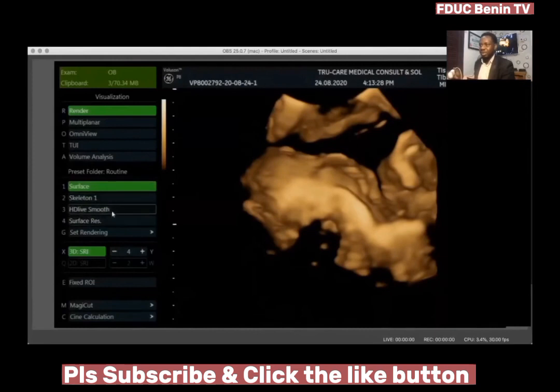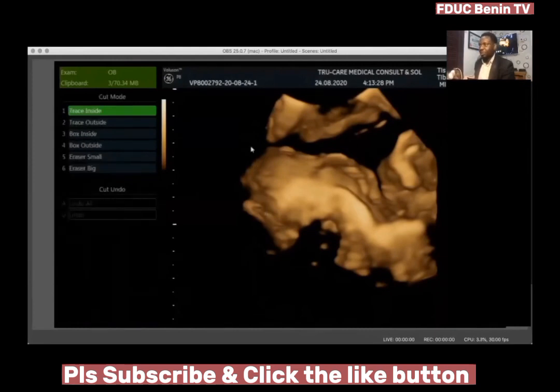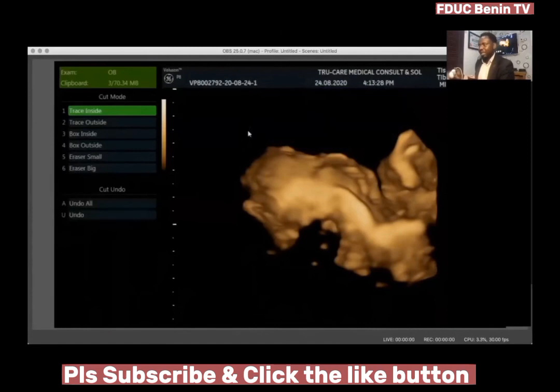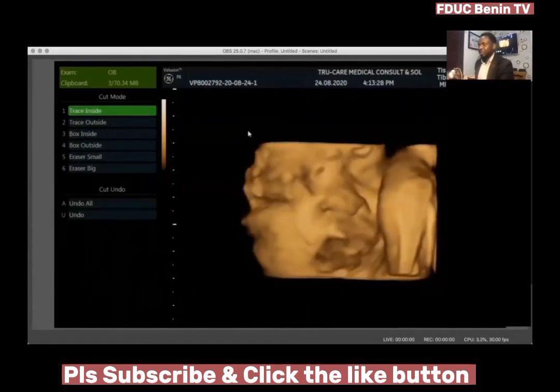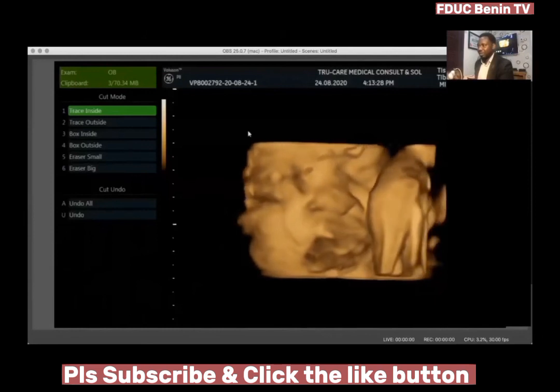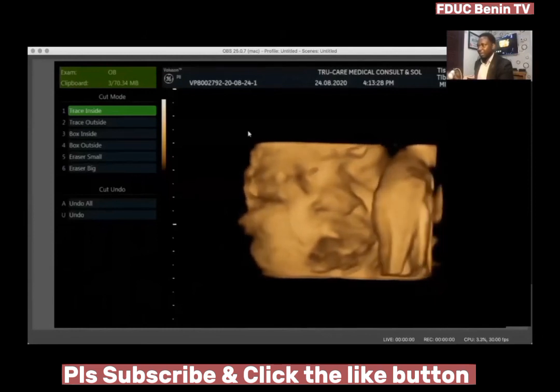So I can quickly come, this very machine has something called magic cut. And for example, if I come over here and apply this tool, I may be able to get this. And now I can rotate back the face, and you notice that, well, I lost a little part of the forehead, but then the nose, now I can undo what I did.